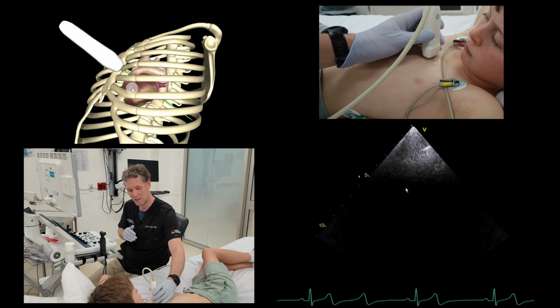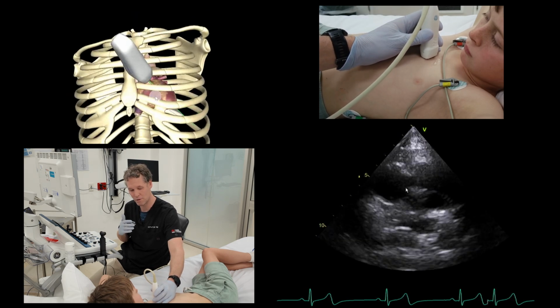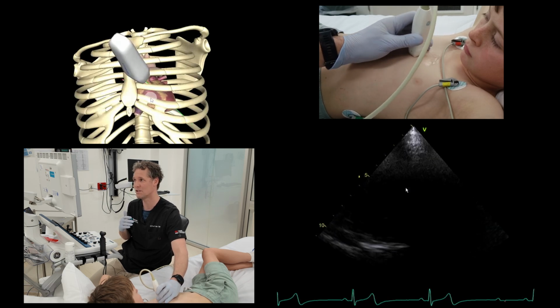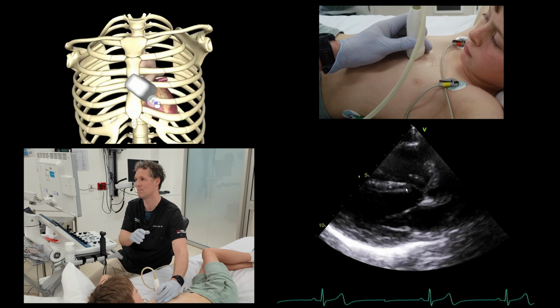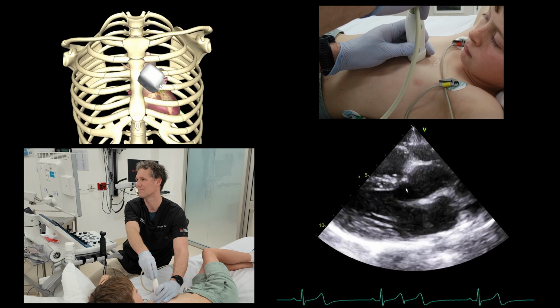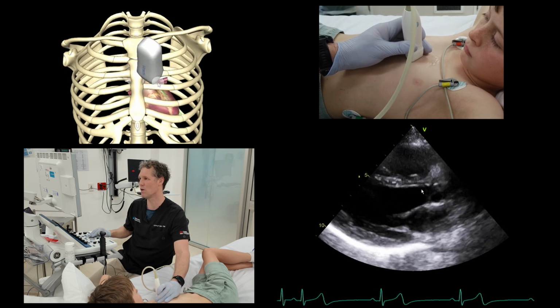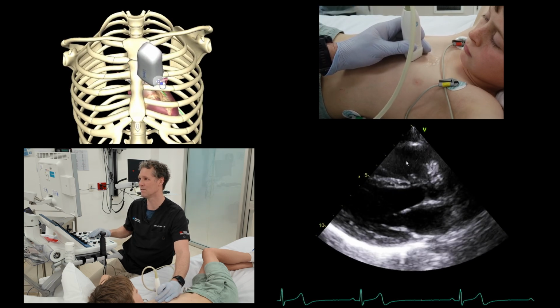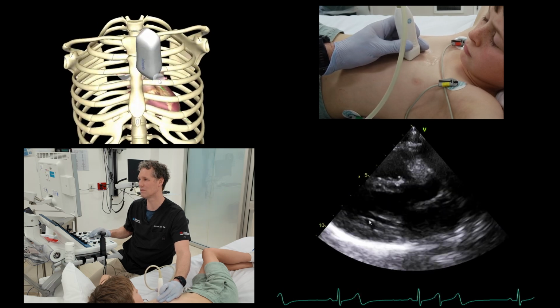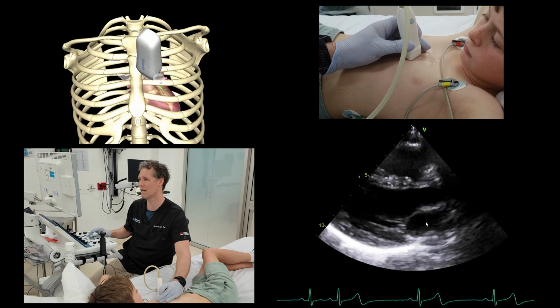With that parasternal long axis view, I'll try and go through each of these views, talking about the orientation that we're after. So first of all, let me show you this. What we're trying to aim for is a picture that looks something like this, where we've got our aortic valve, right ventricle, left ventricle, mitral valve, and left atrium.